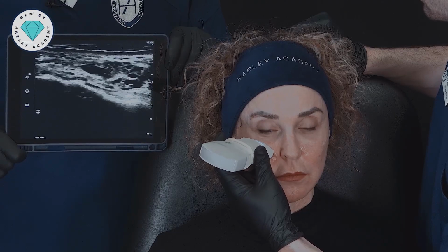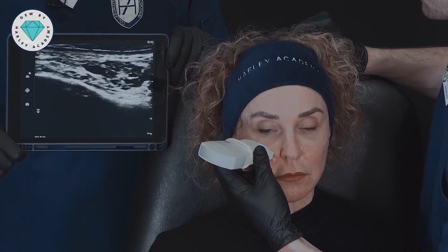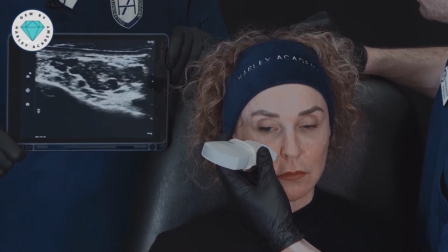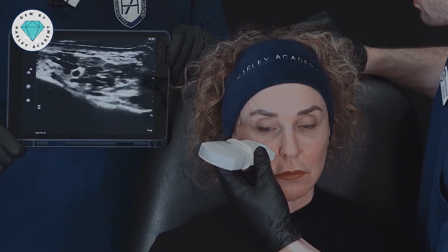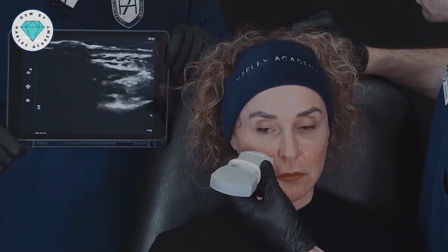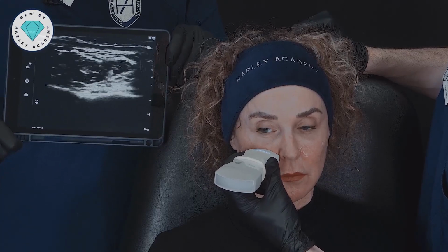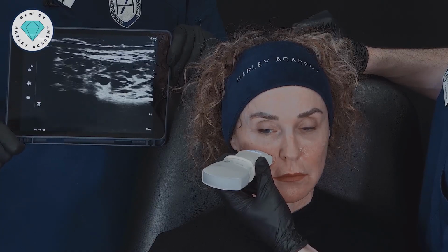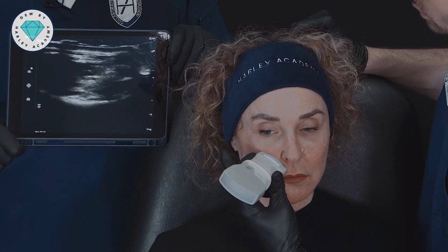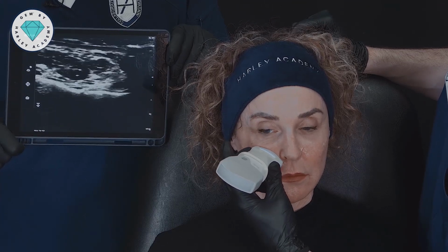the SMAS. Yeah, I think we'd say is that within layer 3? I think it may well be, yeah. Which is actually quite common for mid-face treatments, as we are learning on these ultrasound studies, that filler, unfortunately, is actually quite hard to place in the area that you intend it to. And there are various things we can do as injectors to make sure that the filler does end up in the target that we intend. But this is a good example of having multiple nodules of hyaluronic acid actually found within layer 3.